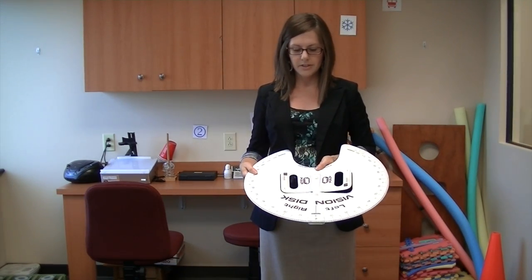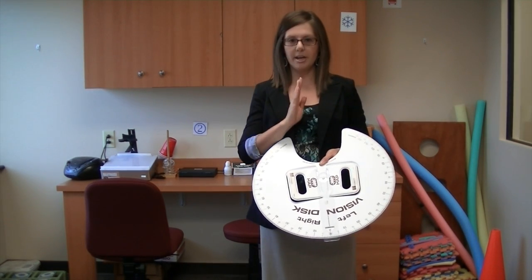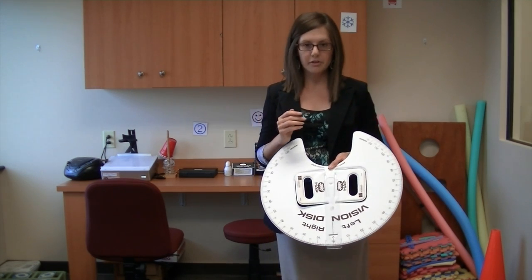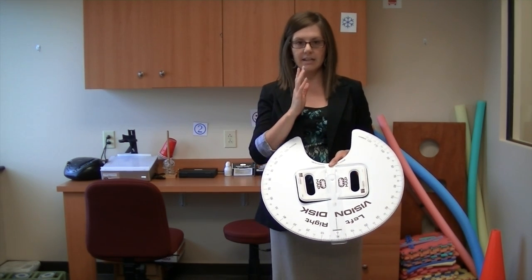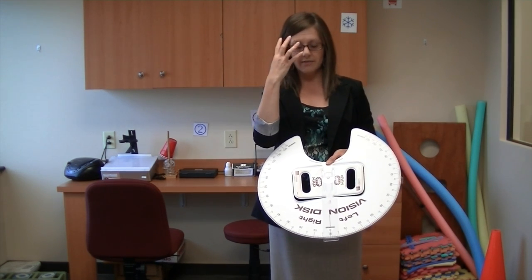The whole idea of using this vision disc is that I want to find out if they are confused about where they think the middle of their body is, and where they think the position of their eye is inside of their head.